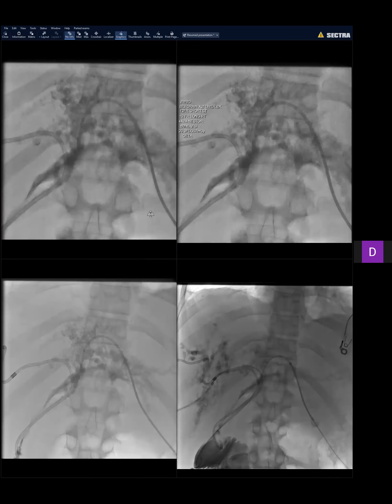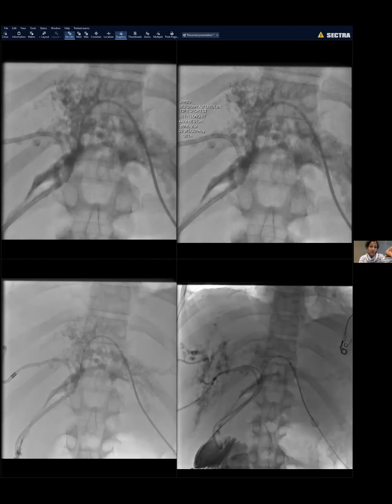Peribiliary cysts won't be seen on a cholangiogram because they are peribiliary and don't communicate with the bile duct system. The cystic dilatation was likely going on for a while before cholangitis developed. Drains were placed to relieve cholangitis — these patients have stasis because of the cyst formation, causing repeated episodes of cholangitis.